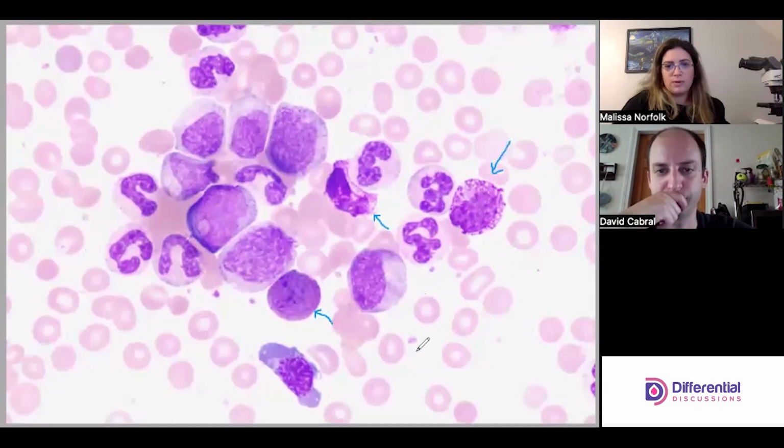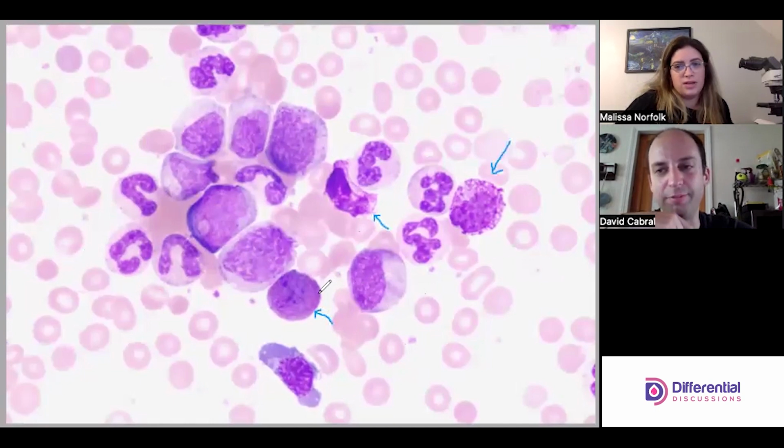And I know people are probably like, it just looks like a giant blob. It's challenging when you're looking at them. You really have to play with the fine tune. And if you'll notice, that's why sometimes the screen goes in and out of focus, is because I'm playing with the fine tune as we're looking at this. But the nucleus is here. I'm a crappy drawer, but it's ish there.